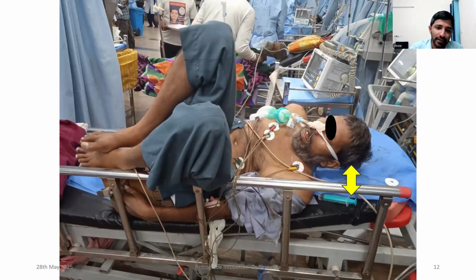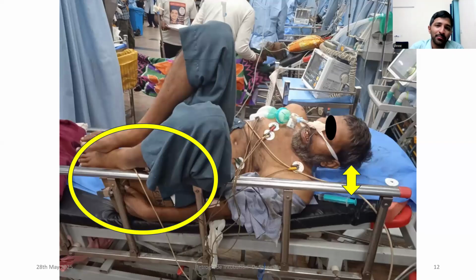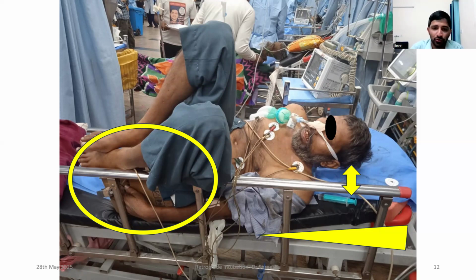You can see that in order to maintain the position of the patient, we had kept a saline-filled box below the patient's legs. Despite that, you can see that due to the limited neck mobility, the head was not exactly touching the bed. So we also had to give a ramped up position in order to maintain this particular position, so that the patient could lie supine for us to intubate him.